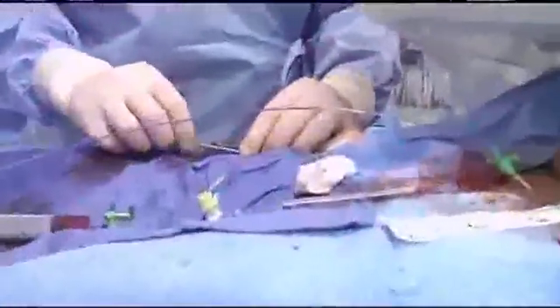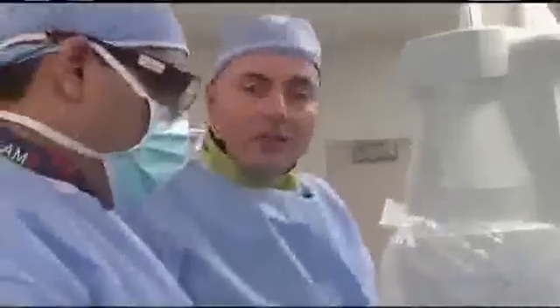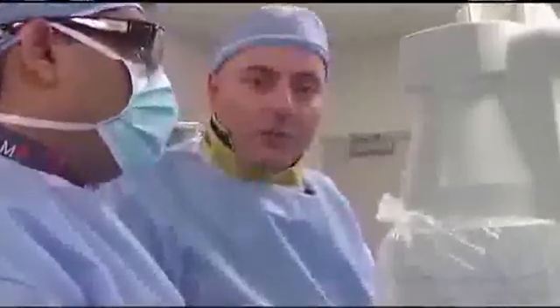At this point, we place the stents exactly adjacent to each other, and I'm going to unsheath the left common iliac stent by pulling my sheath back, which allows me better measurements. Okay? That's 28 millimeters. We're at 28 millimeters. We're talking apples to apples. Prepare for simultaneous kissing stents. Now, simultaneously deploy both stents, and we're going to do it slowly since it might slip.